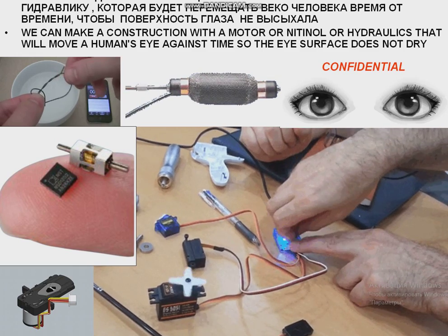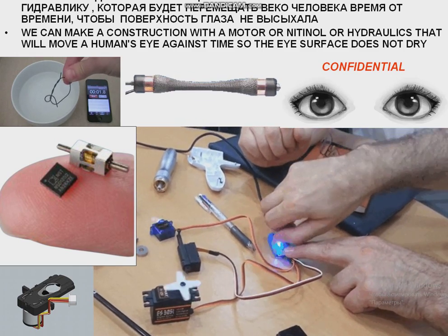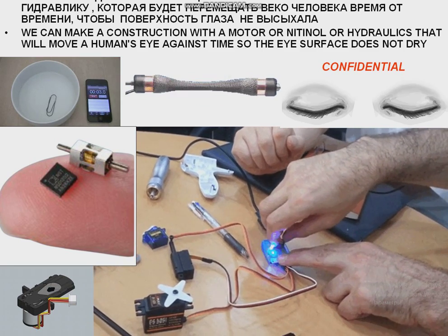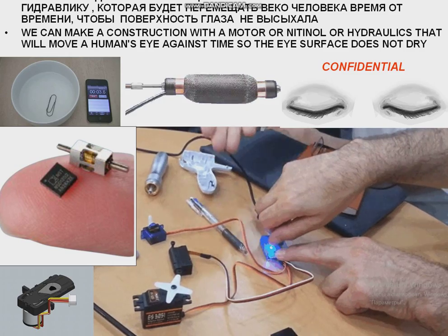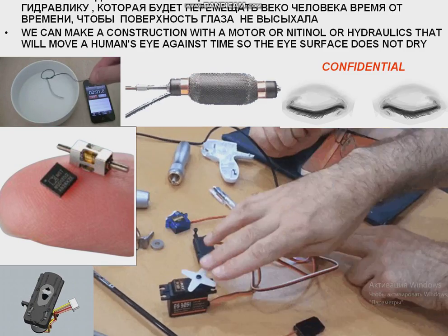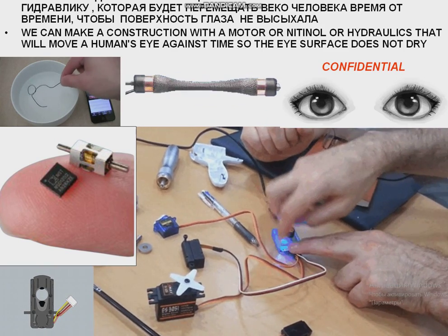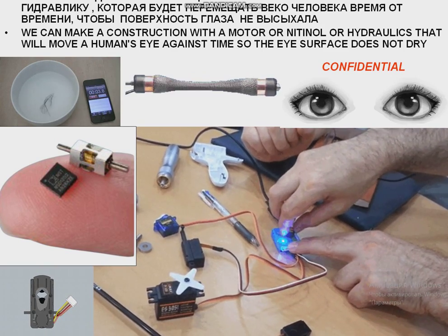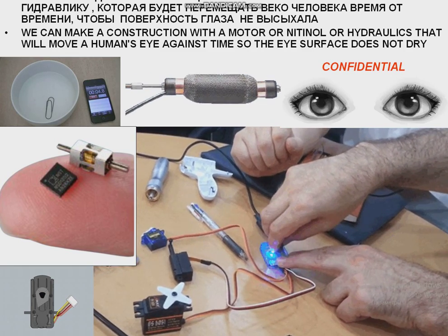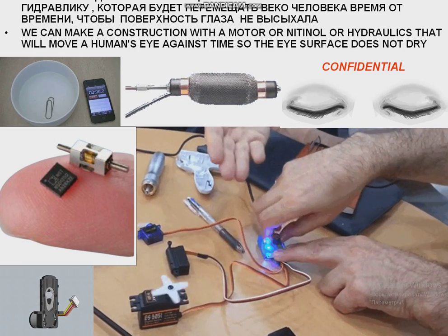We can consider different versions of design. What can be concept number 1, concept number 2, concept number 3. You can see concept number 1. It can be the application of an electrical motor, controller and regulation, or we can apply artificial muscles from air or from liquid, or we can apply shape memory material.